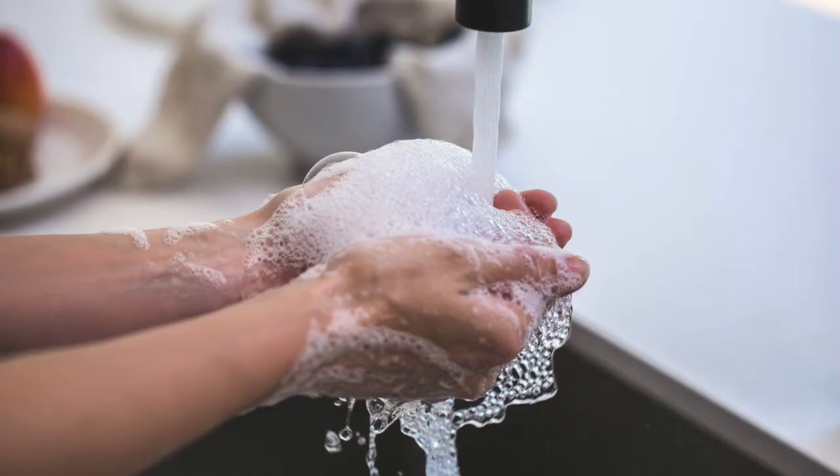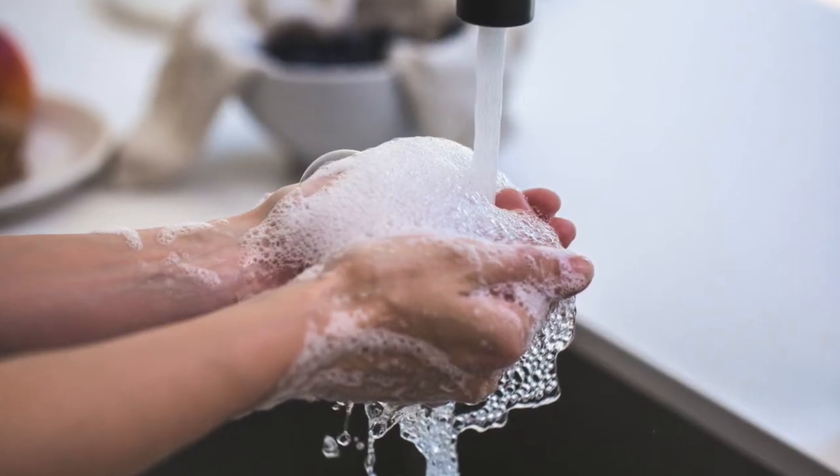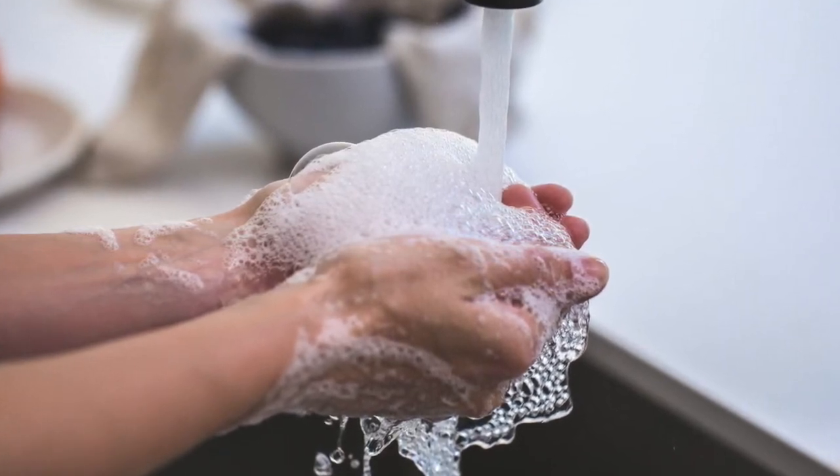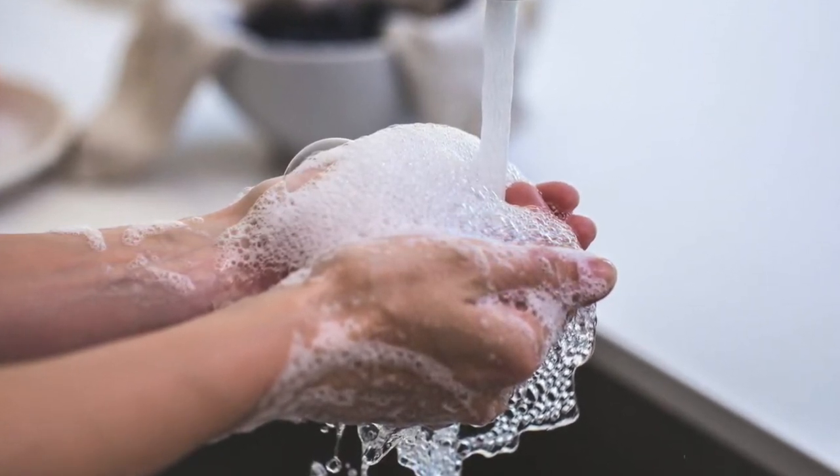The first step is to always wash your hands. You want to make sure that your hands are clean so that you can make your nebulized colistin in the safest way possible.